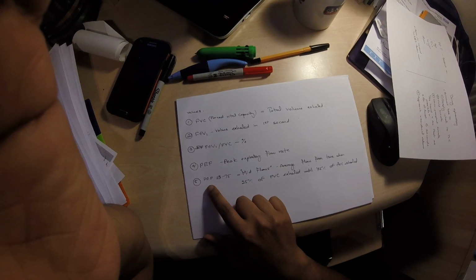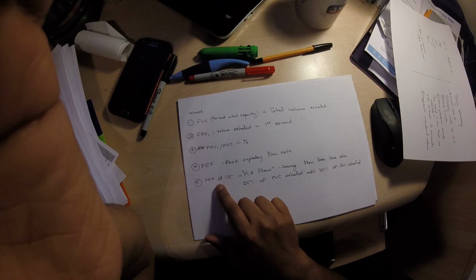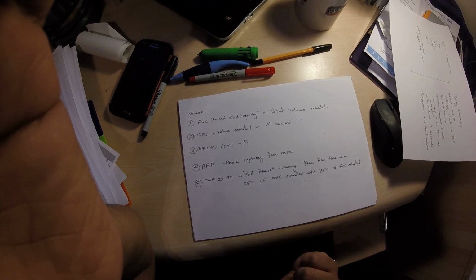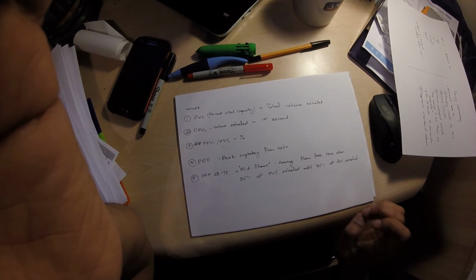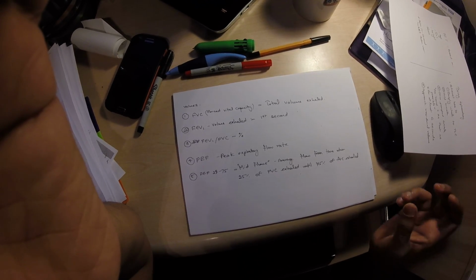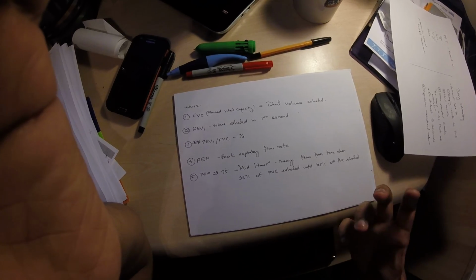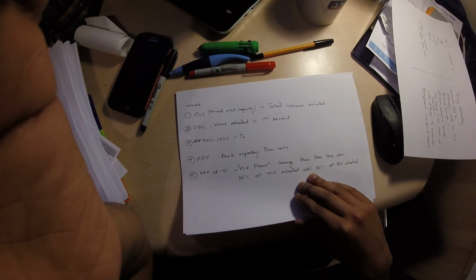Also, we get an FEF, which is mid flows. It's FEF 25 to 75, but what it means is the average of flow from the time when 25% of the FVC is exhaled until 75% of the FVC is exhaled. So it's a mid zone, the mid 50% of the forced expiratory flow, that gives us an FEF value.